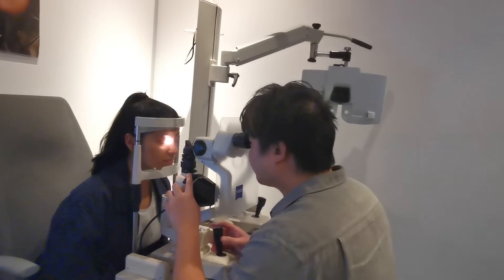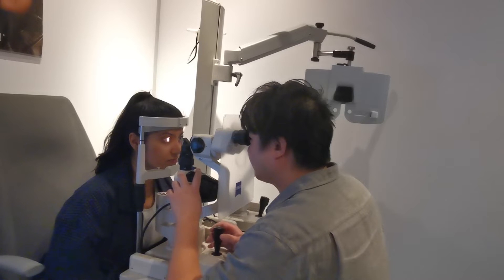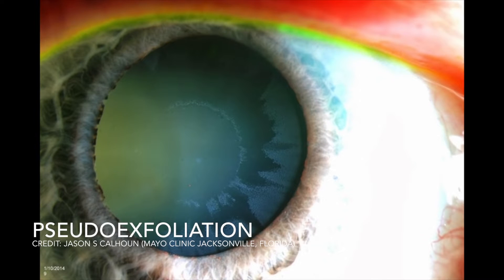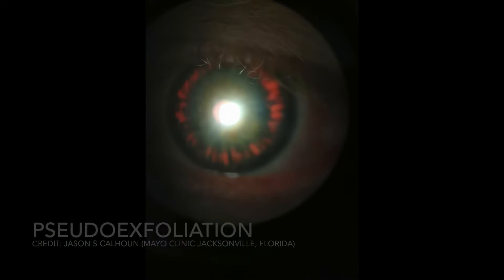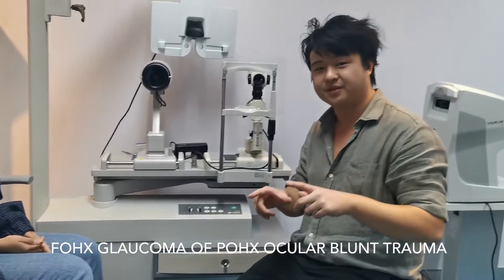Some of the clinical indications I look for when doing gonioscopy are, of course, narrow angles. So I'm looking for a Van Herrick that appears less than or equal to 0.3, as well as secondary glaucoma signs such as pseudo-exfoliative material and pigment dispersion. Family history of glaucoma and history of blunt trauma to the eye are also important information to find out.